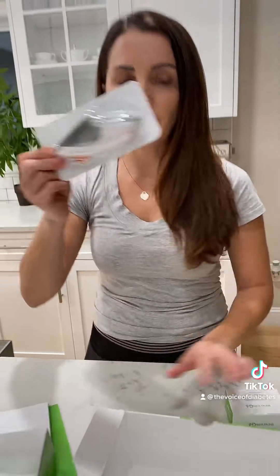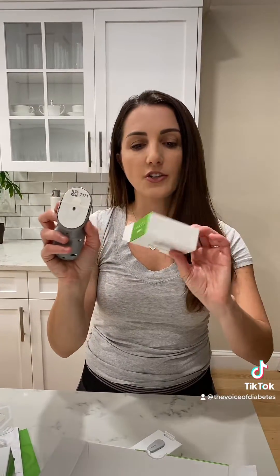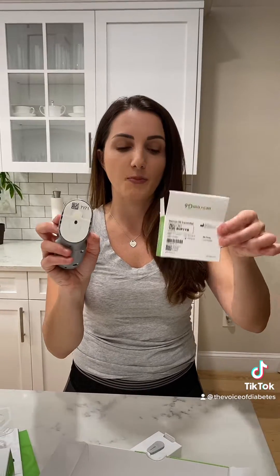Open up the kits. This is the sensor and this is the transmitter. The transmitter is very tiny right over here. Remember you're going to need the serial number codes, because when you're on the app it will ask you for this code and the serial number — and you can actually take pictures of them, which is pretty cool.